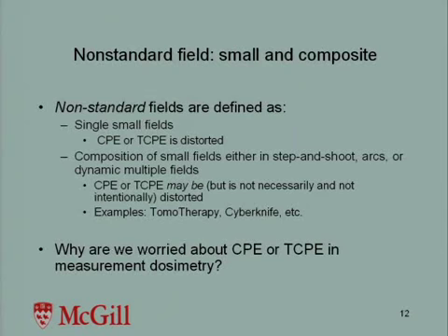So what are non-standard fields? These can be either small or composite. Both of them you can call non-standard. Single small fields, in which case charged particle equilibrium is not present, or composite fields, in which case we don't know. It could be that charged particle equilibrium is present, but it could also be not the case, and it depends on what kind of deliveries you provoke.